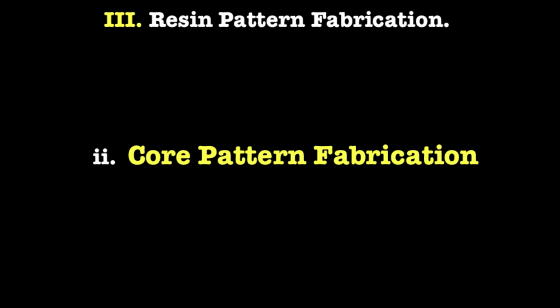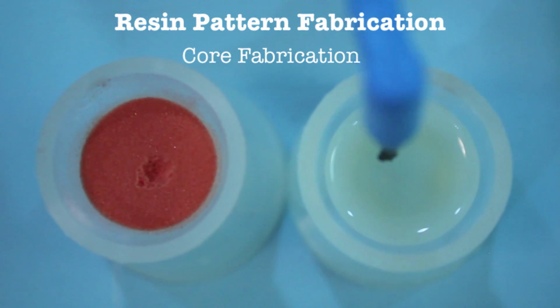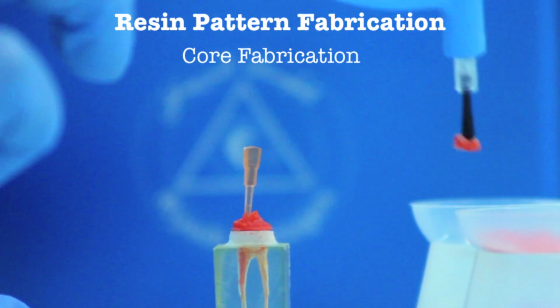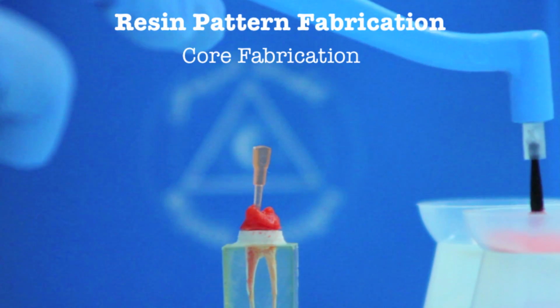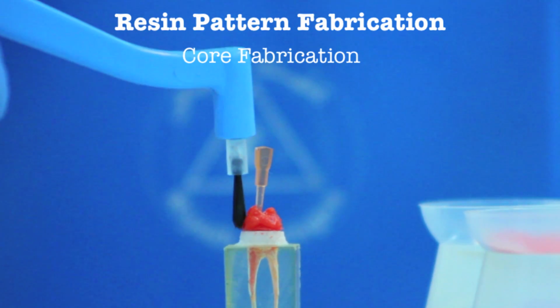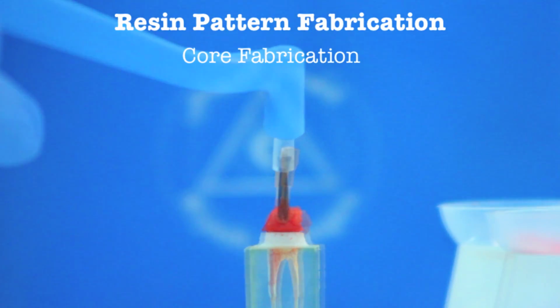Core pattern fabrication. To build the core, add resin by dipping a small brush in monomer and then into the polymer. Lightly overbuild the core and let it polymerize fully.